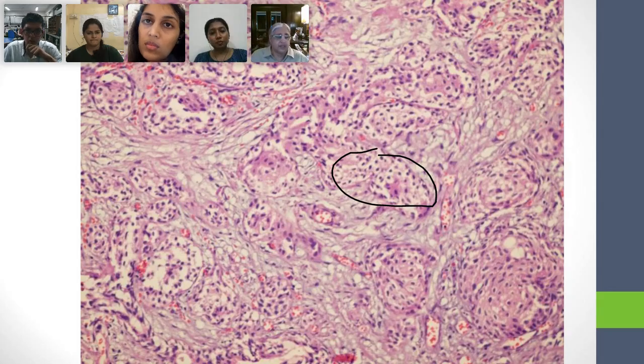Please get out of this dirty habit, all of you, of looking at the nuclei and saying that that's the shape of the cell. The shape of the cell is cuboidal. You're just saying that you're seeing round cells with distinct nuclei, distinct borders. No. So it's cuboidal, they're all cuboidal. They're clearish and they have very dense looking nuclei that are in the center of the cell.